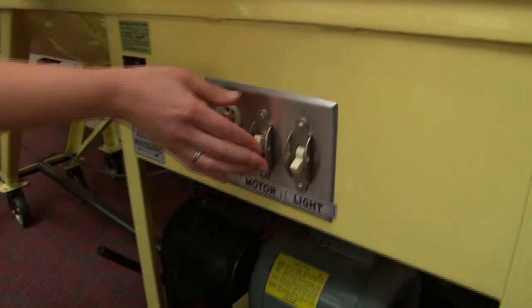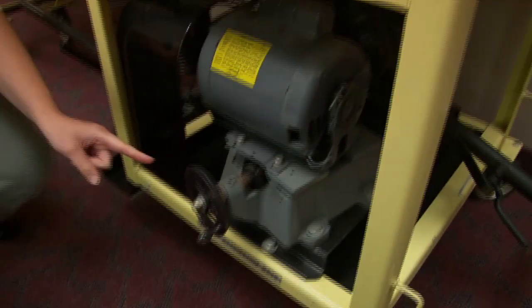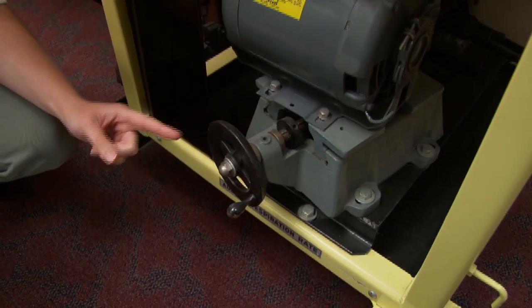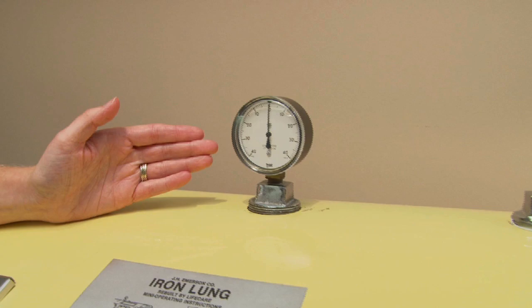The switch for the motor is on the front, along with a switch for the light inside the chamber. At the bottom is a knob that controls the respiration rate of the machine. It can go between 12 and 20 breaths per minute. Along the top is a gauge that measures the pressure inside the chamber.